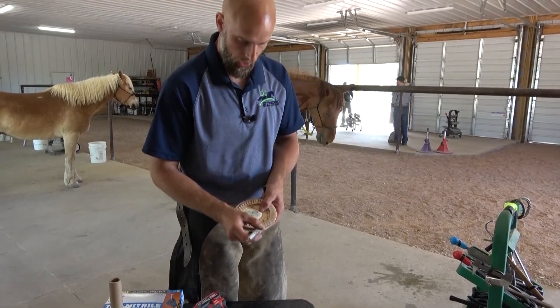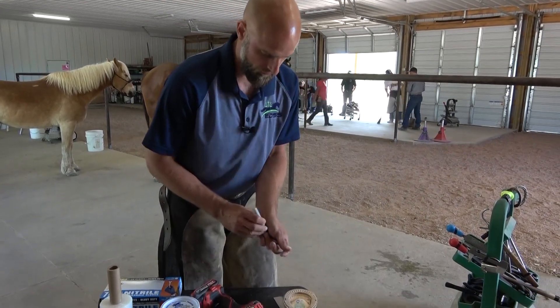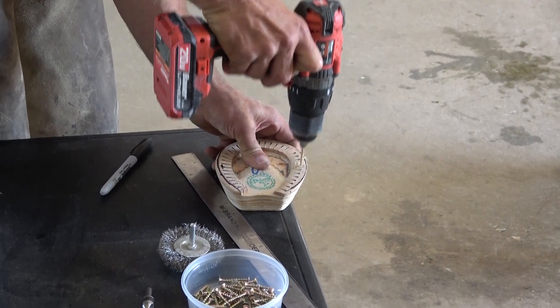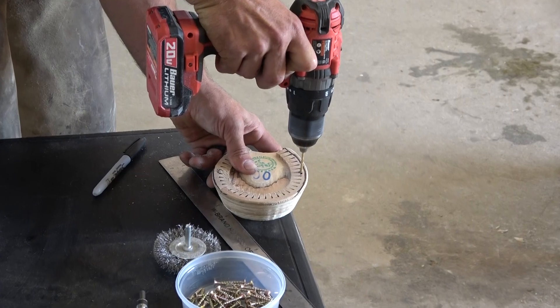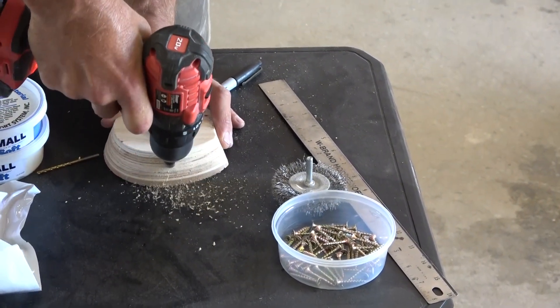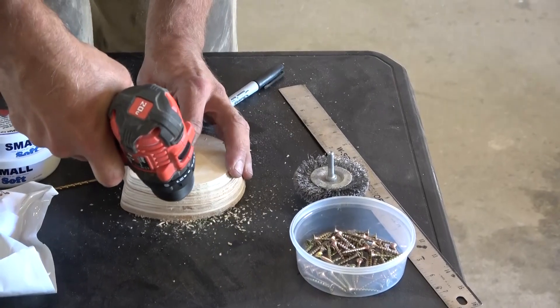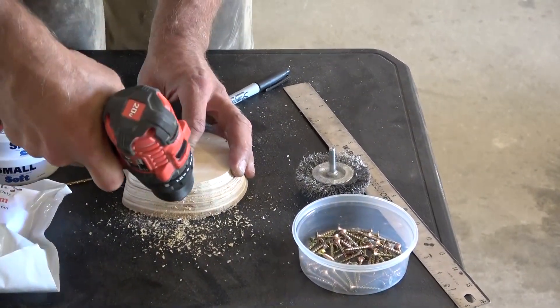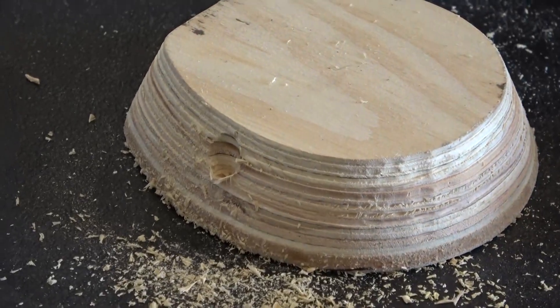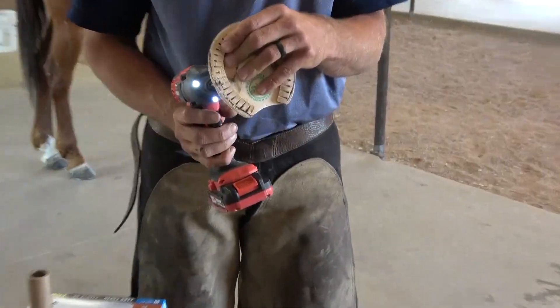So I've marked where our screw needs to go through. It essentially goes in the wall, and I'm going to drill from the bottom down so I can then come back with the countersink bit. Now I'm going to check the length of my screw, see if I like it, if it's going to have enough attachment — and it does. That's enough to hold the screw.